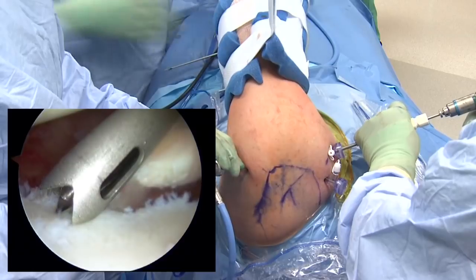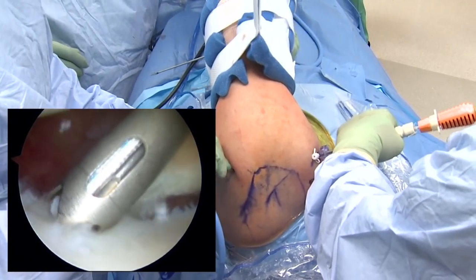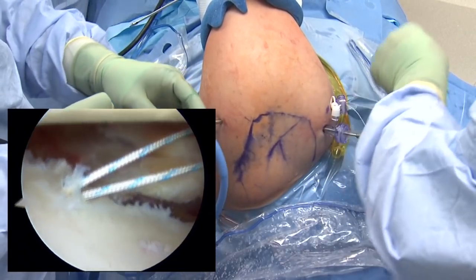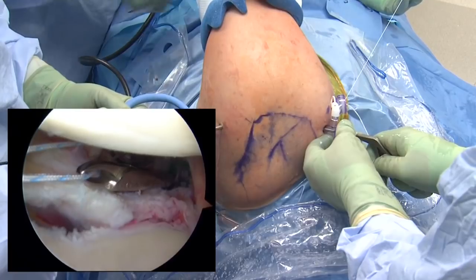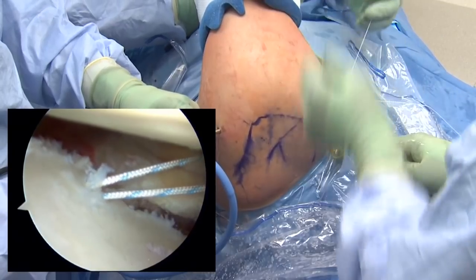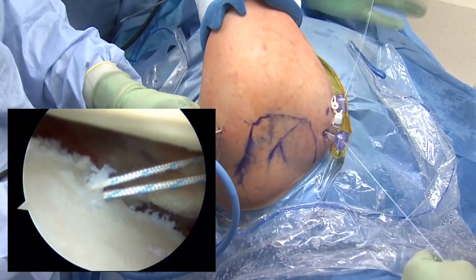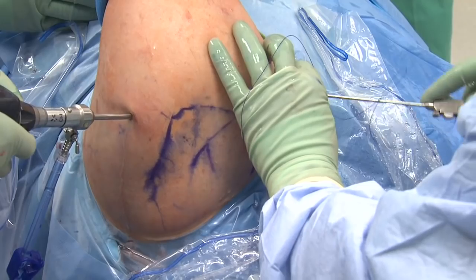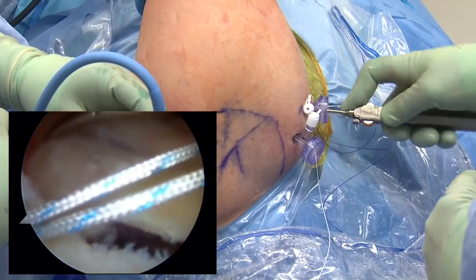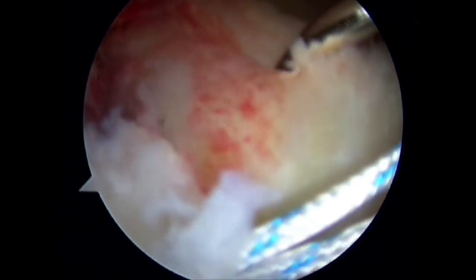Our first hole is at the inferior five o'clock position so we can pull upwards on the Bankart and the capsule. We insert our anchor, and we like to work with one suture to keep it simple. We pass our device with a PDS. Note that pulling on the suture slides both ways, which means we could pull it out of the eyelet — so we must secure one arm of the suture to ensure we don't pull it out of the eyelet, which is a critical step. We then use a passing device — there are various ones commercially available — and pass from right to left through capsule and labrum to shuttle our sutures for tying.